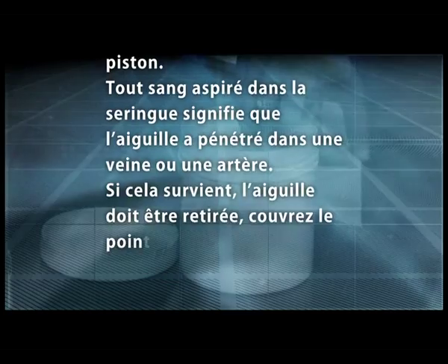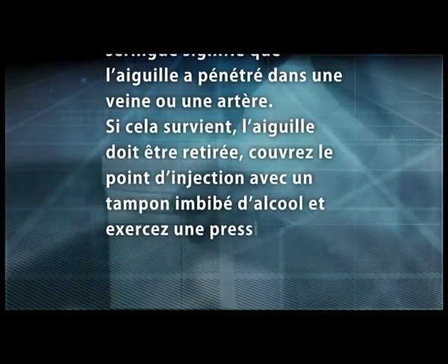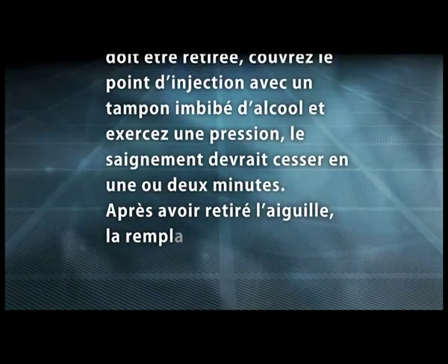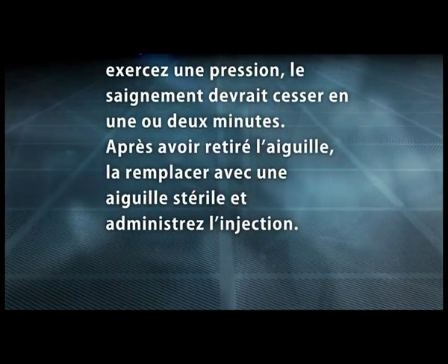If this happens, the needle should be withdrawn, cover the injection site with a swab containing alcohol and apply pressure. The site should stop bleeding in a minute or two. After withdrawing the needle, replace it with a sterile needle and administer the injection.